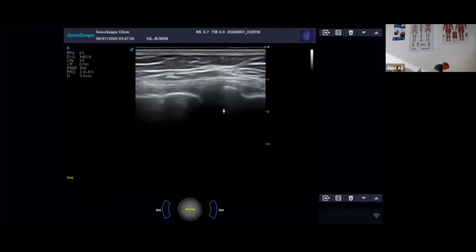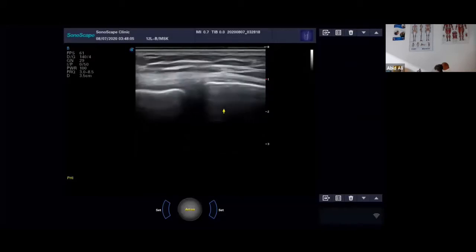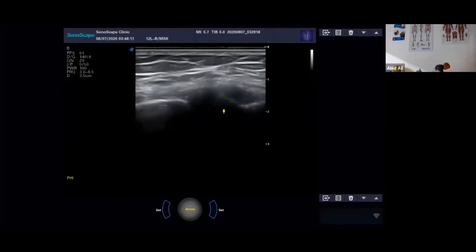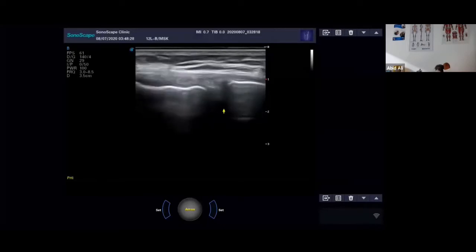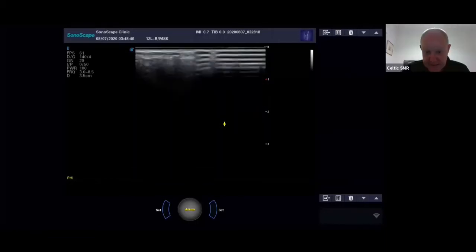You do need to set your settings right when you're calling Doppler things. So, see many from rheumatology? I mean, hands and feet. I don't, to be honest. Rheumatology, they just tend to send me hands, wrists. Yeah. They don't send many requests for knees through rheumatology. Obviously, you can, but I suppose they send their aspirates and other investigations. MRI seems to be the standard, doesn't it? I think really when they come to me, they're trying to pick up rheumatology appearances for the first time, subclinical synovitis, and that tends to present in the hands first. So that's probably why I just get hands and wrists, and then once they know it's there, they can look at other things with different modalities. Did that answer the question there, Steve? I think it did. I'm sure Elaine will come back to me if not.